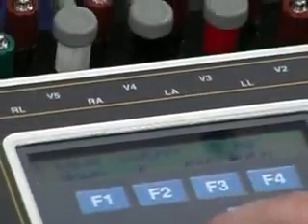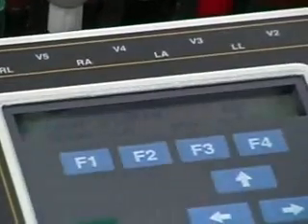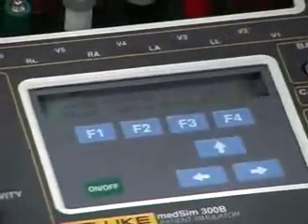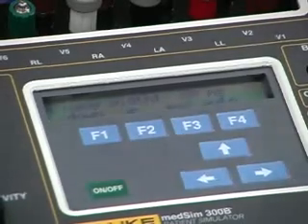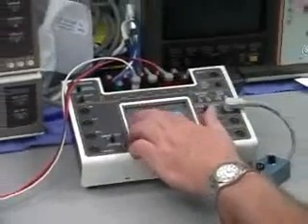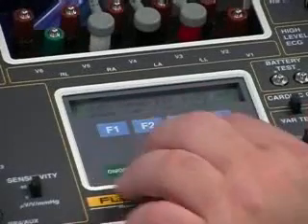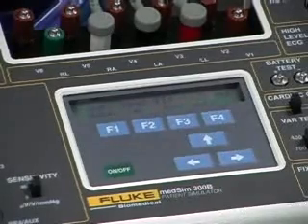One of the reasons we developed this is that we talked to many hospitals who said, I'm having a problem with my rate meter. It's not picking up the patient's ECG. I said, well, what's the ECG look like? They said, well, it's an older person with a wider R wave complex. So I say, it's a wide one? Okay, so you say it's about 160 milliseconds? They said, yeah. And then I said, well, what's the amplitude? Well, I don't know. So let's just say it's 1.5 millivolts, something like that. He said, yeah. I said, okay, well, there it is.